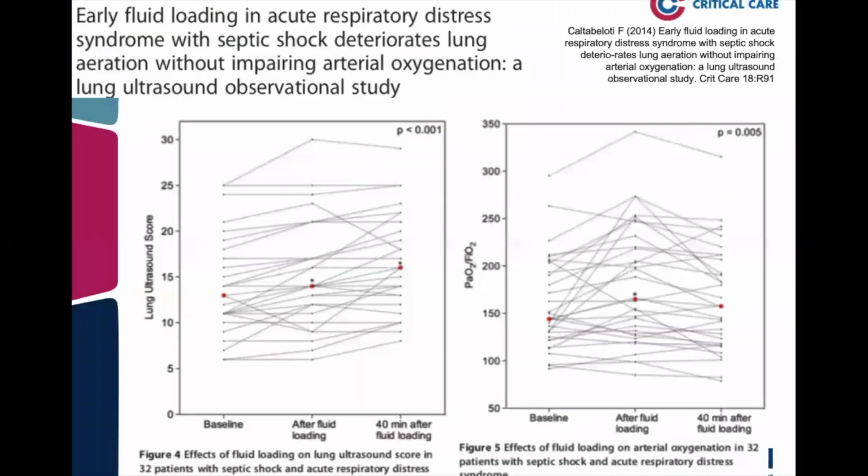So moving on from ultrasound use in intubations, the ability of lung ultrasound to rapidly evaluate for the development or resolution of B lines as a surrogate for extravascular lung water is something that people have looked at. And this is a study looking at its ability to identify B lines to guide fluid administration during the initial resuscitation period in sepsis.